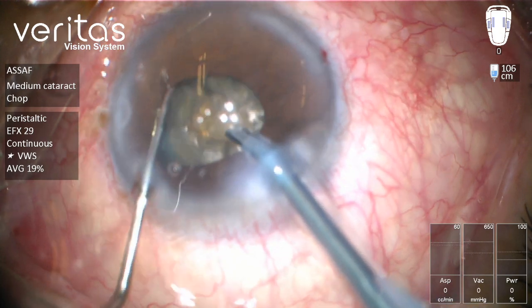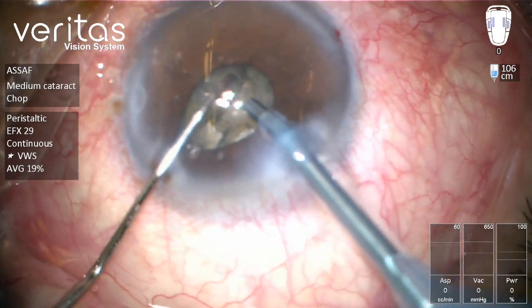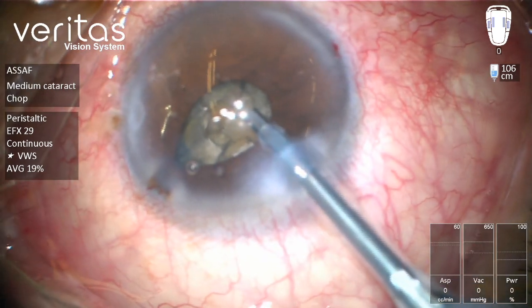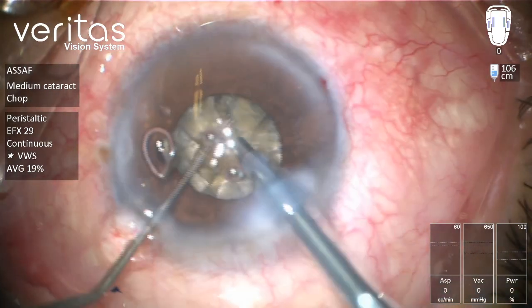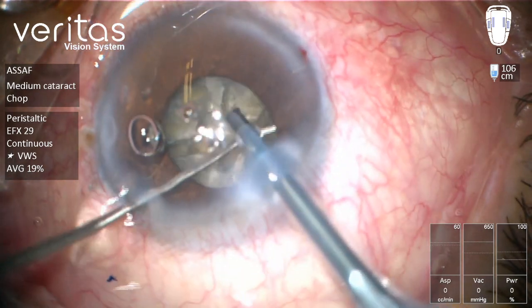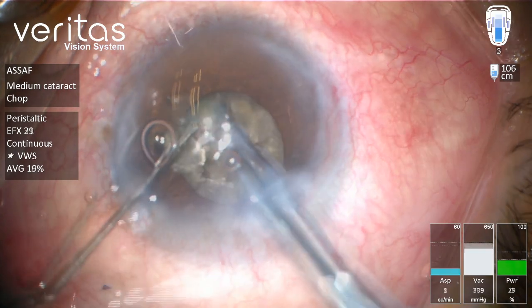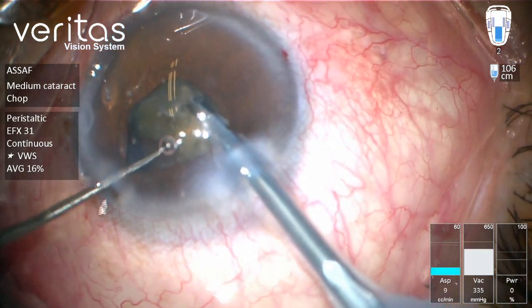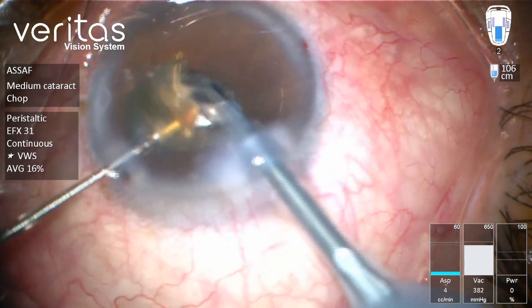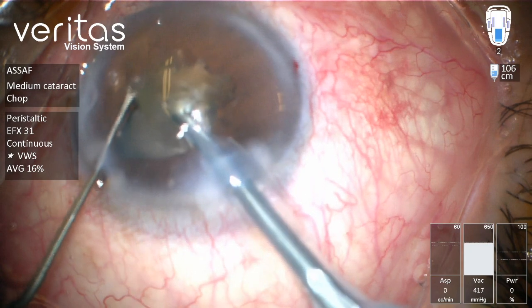Now we have a kind of flower petal appearance, so I'm going to switch to the nuclear manipulator, trying to find one of those quadrants to impale. I'm going to pass behind the quadrant to cut this posterior isthmus. Now we have three quadrants and can emulsify in the supracapsular plane.